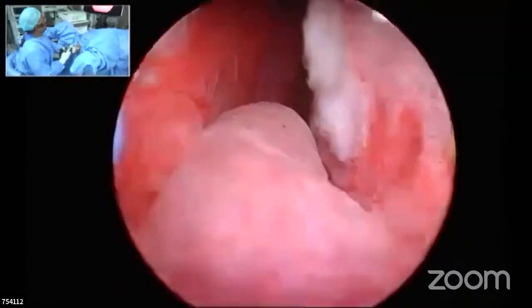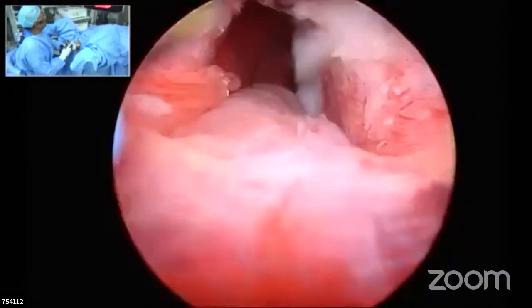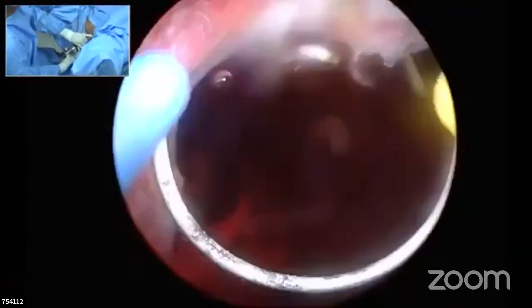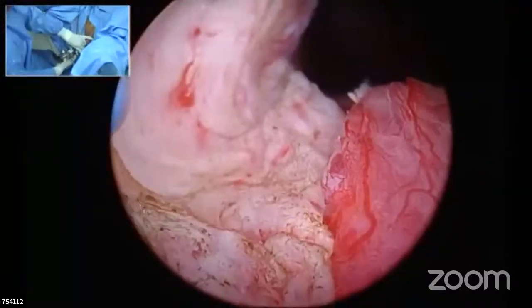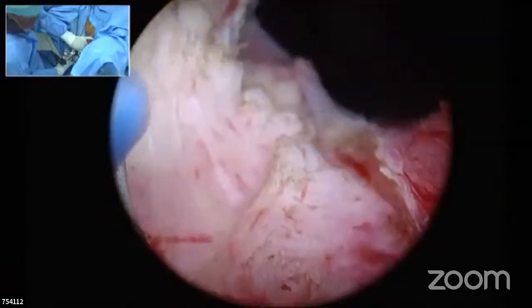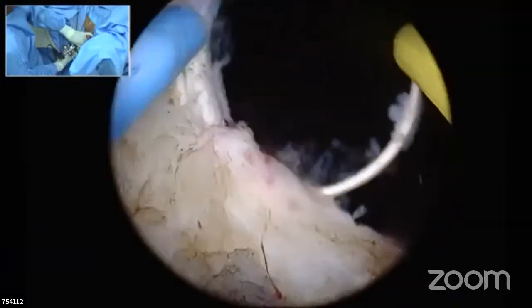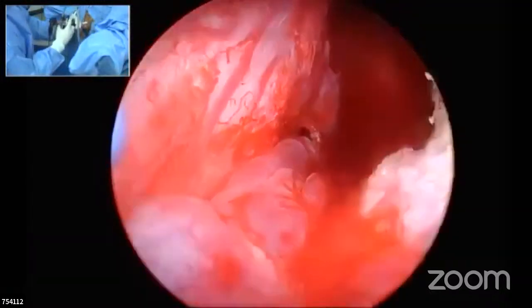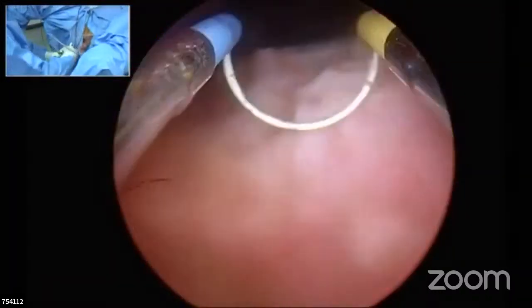Yes, sir. Very nicely demonstrated. One more thing is there. I just forgot to mention. You mentioned about where to cut and not to cut. One principle is, please, when you are cutting the tissue which you are seeing through your resectoscope, that you are cutting actually. So don't move blindly, don't cut blindly anywhere. So what you see, cut only that. So inadvertently you will not be cutting here, there, or beyond a sphincter or something. So always keep in mind that what you are seeing, that you are cutting.